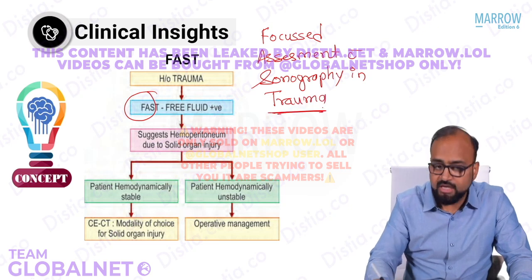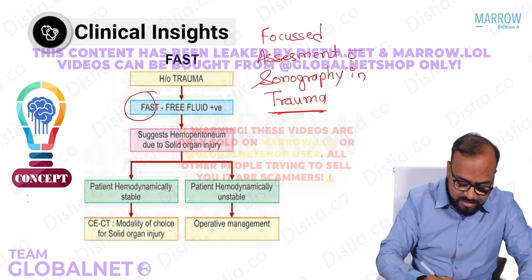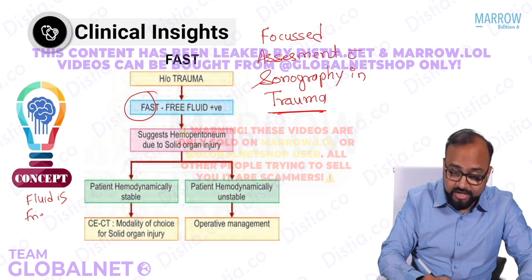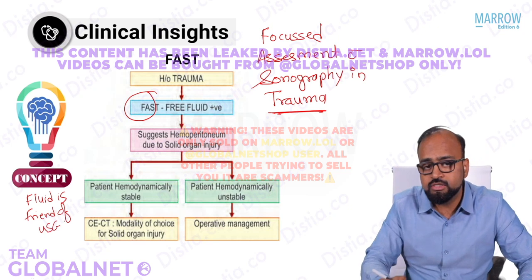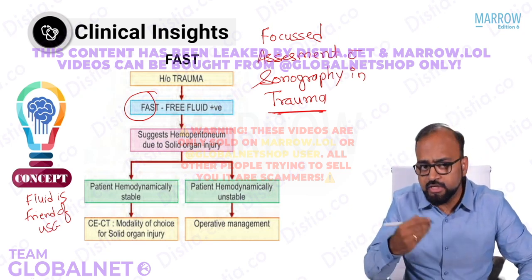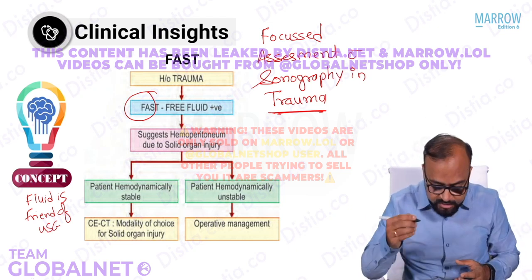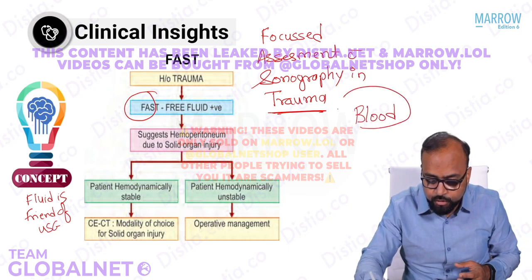What is the concept of FAST? The concept of FAST is the same concept that we have studied about ultrasound, and that is fluid is friend of ultrasound. What is the purpose of doing FAST? The purpose of doing FAST is to detect intraperitoneal free fluid. If there is free fluid within the peritoneal cavity in an abdominal trauma patient, it means that that fluid is not just clear fluid, but that fluid is going to be blood.